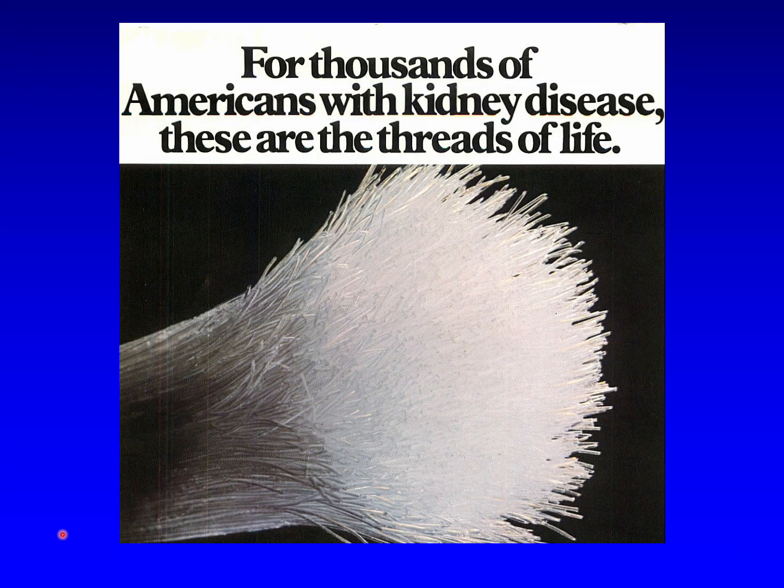Although the very first dialysis membranes were flat and about the size of a coffee table, current dialyzers achieve more surface area in a compact space by being made in the form of capillary-like hollow fibers with fenestrations along their entire length, about 10,000 of them in a single dialysis cartridge. The patient's blood flows through the capillaries, and dialysate solution flows past the outsides of the fibers and runs down the drain, carrying the molecules that diffuse from the plasma along with any ultrafiltrate that gets pulled out.